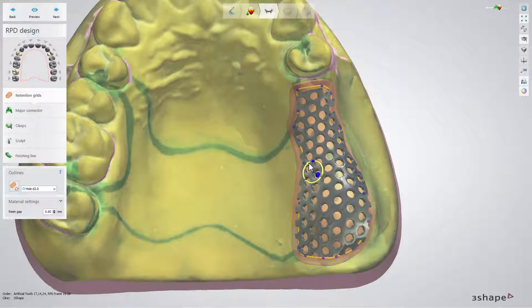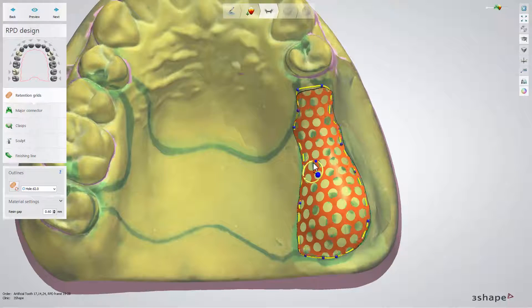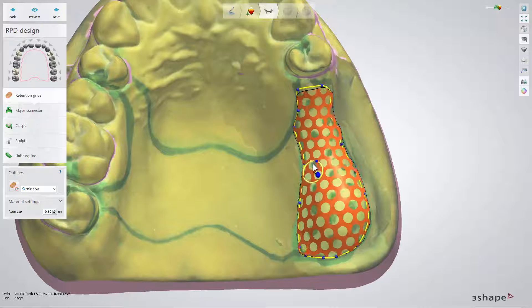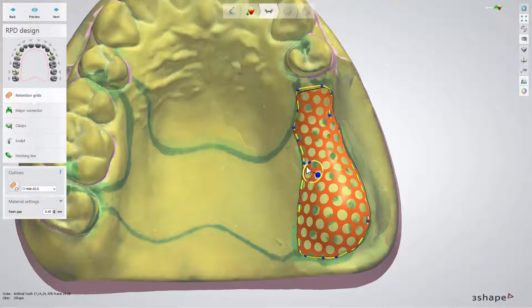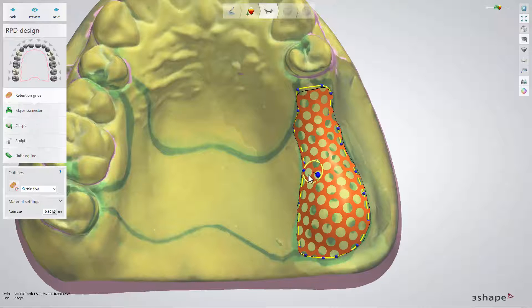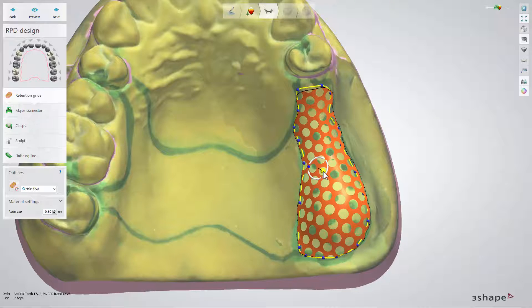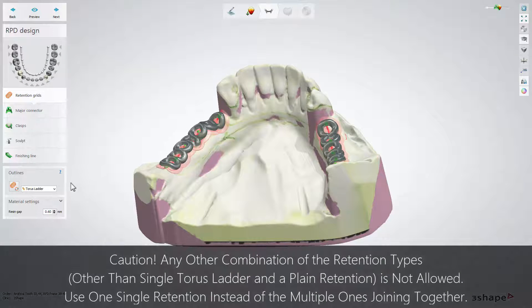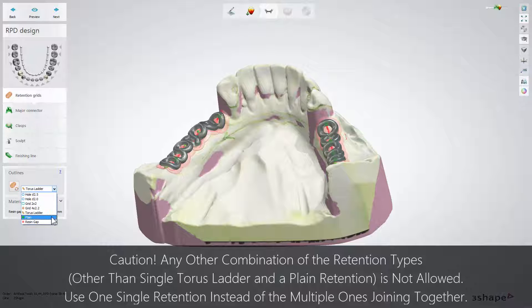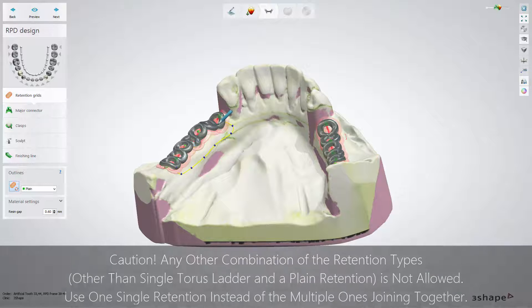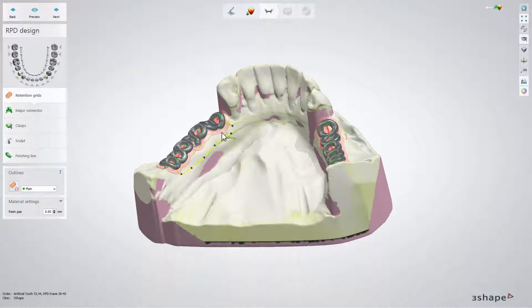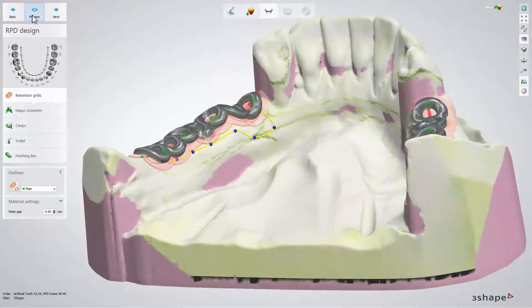It is possible to change the grid pattern's orientation with the help of a joystick. Activate it by selecting the respective retention outline with a mouse click. Creating the retention structures on the lower jaw is mainly done by combining a torus ladder with a plain grid. To see the result, click Preview.